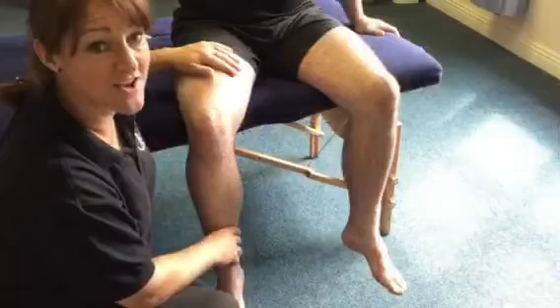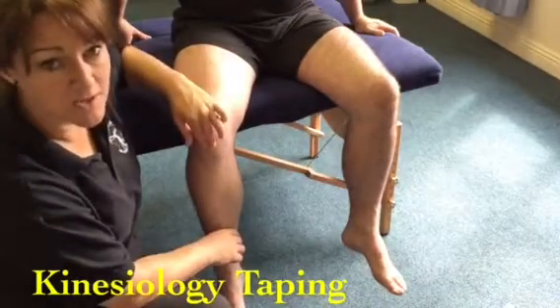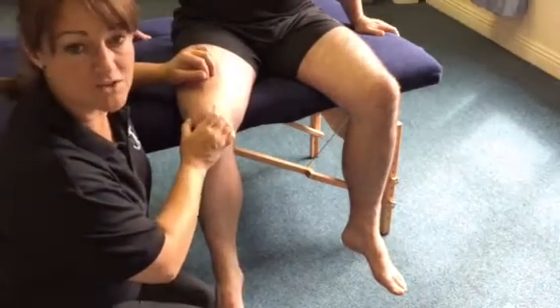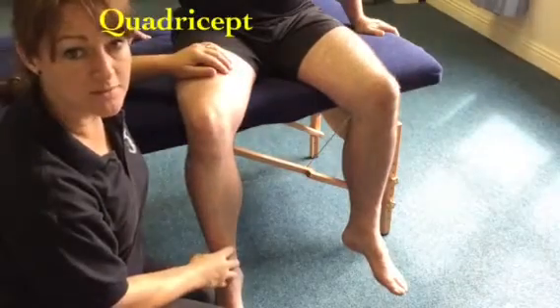Hello, my name is Rachel McCarthy. Welcome to the Institute of Massage and Sports Therapy. We're going to do kinesiology taping for the quadricep and also for patella tendon pain — for someone having pain coming down through here, or maybe a chondromalacia patella or a patella tracking problem, with pain around the kneecap, and to help unload the quads a little bit.